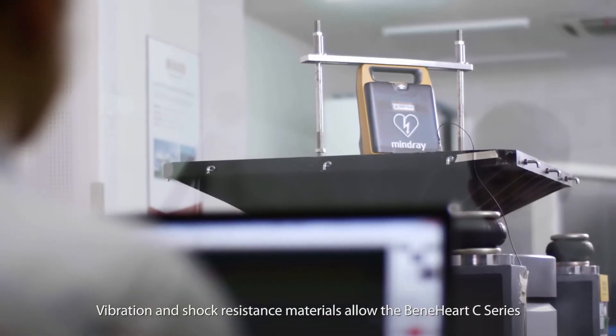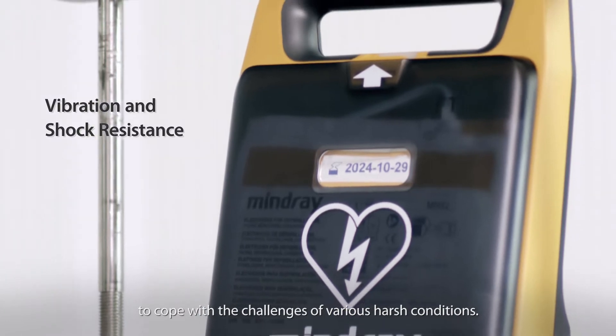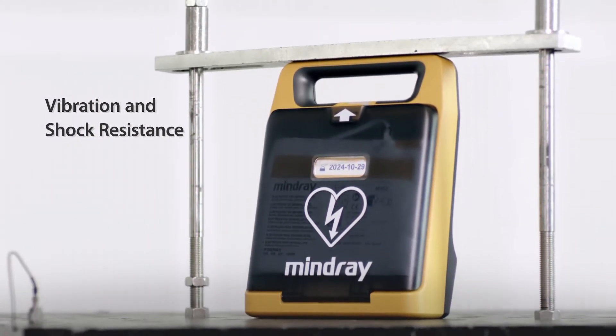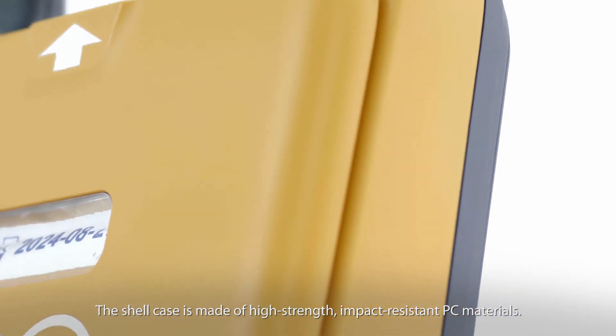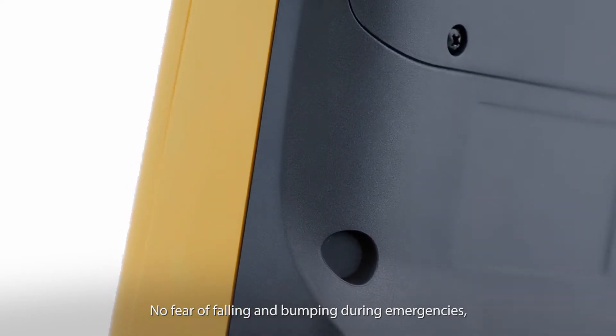Vibration and shock resistance materials allow the Benihart C-Series to cope with the challenges of various harsh conditions. The shell case is made of high-strength, impact-resistant PC materials — no fear of falling and bumping during emergencies.